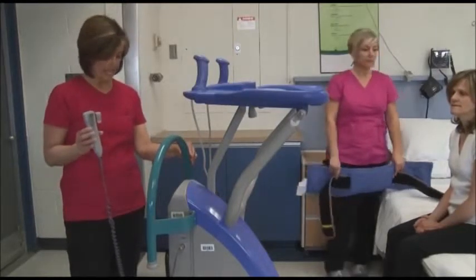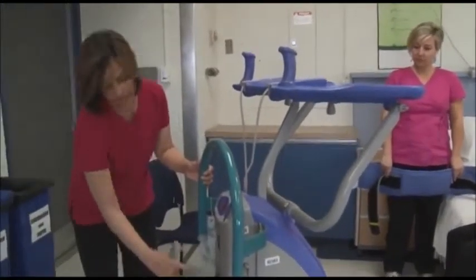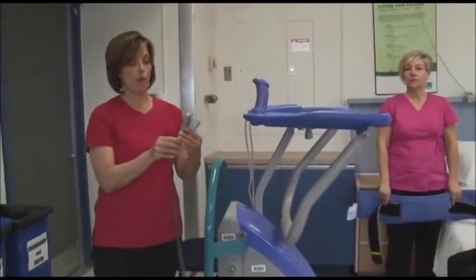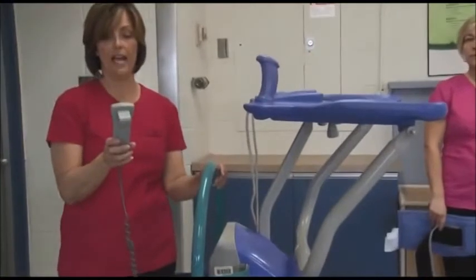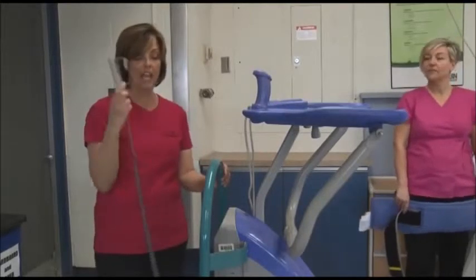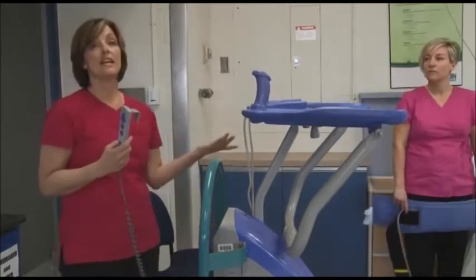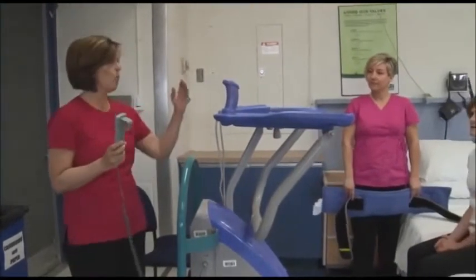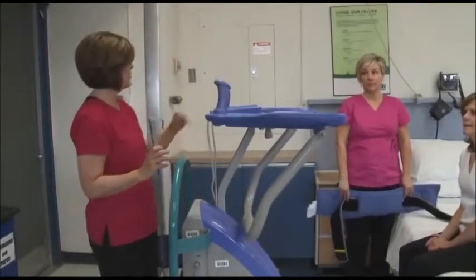In terms of lifts, this lift actually has an on and off button here, so at the bottom, the green button to make sure it works. In addition, it has controls for raising and lowering and widening the base support of the lift around bed casters or chair legs. It's a handheld control, or it can be used on the machine as well. Just as with the other lifts, we always use two people when we're working the lift, and the one person is to work the lift, and the other person's responsibility is to ensure client safety.